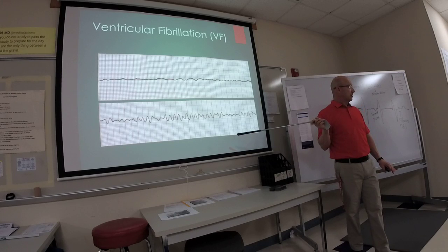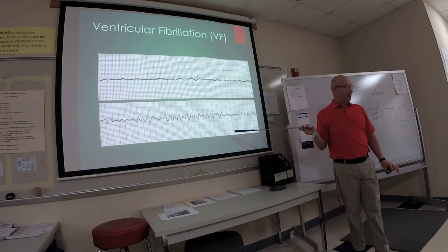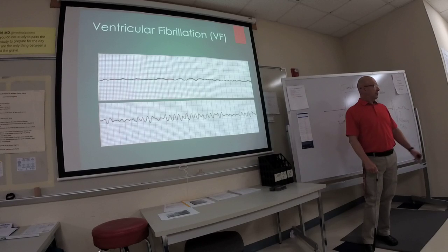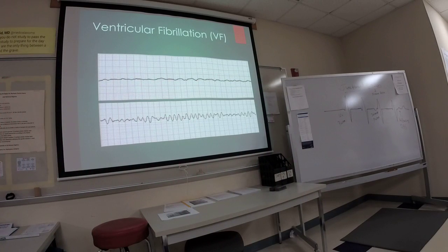If in doubt, get a nurse, right? You can check the patient right quick. Are they breathing? Oh yeah, they're breathing. It just must be the monitor. Okay? You're quite overqualified to do that. You're quite capable of that. When in doubt, inform the nurse. It could be V-fib. If you don't, what are they going to say to you? What were you doing? Why didn't you come get us? Why didn't you come get somebody? Right? So they looked at me. Yeah, if they're talking to you, they're not in V-fib.